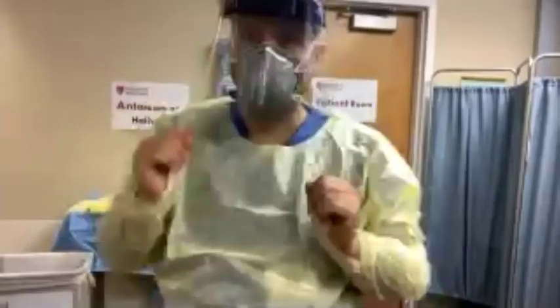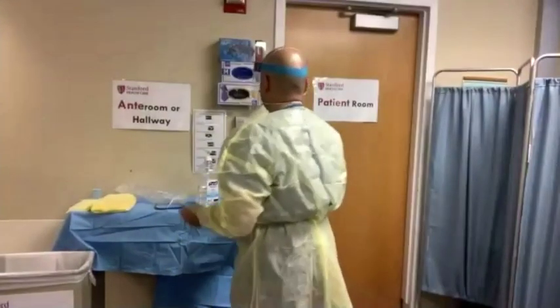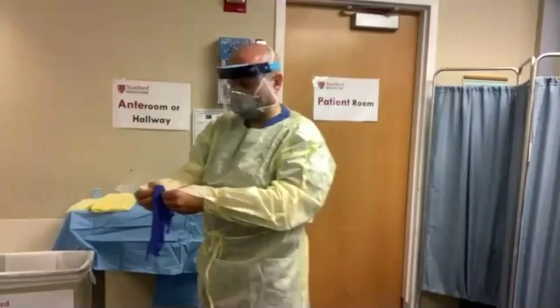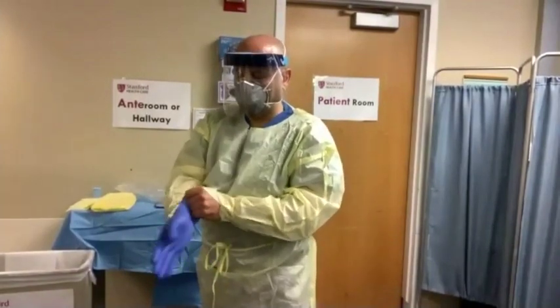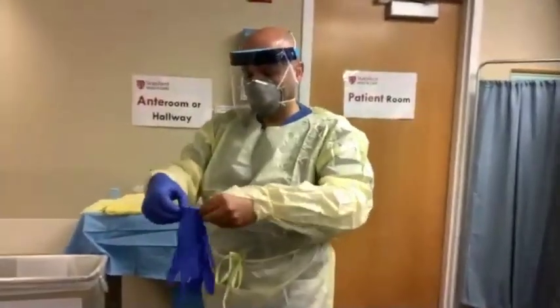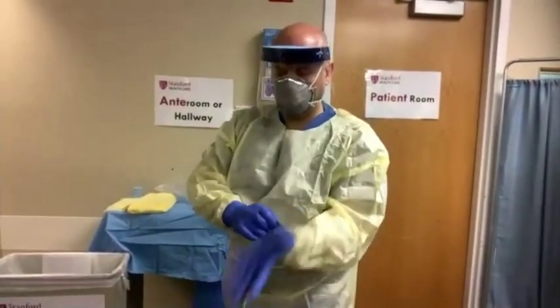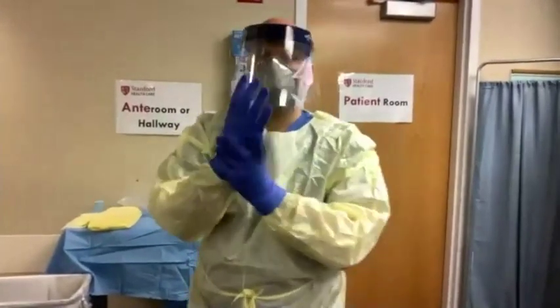The final step is to put on your gloves outside of the patient room or the anteroom. Make sure that the cuff of the gloves goes over the cuff of your gown so that no skin of your wrist is exposed. Dr. Nassar is now ready to enter the patient's room.